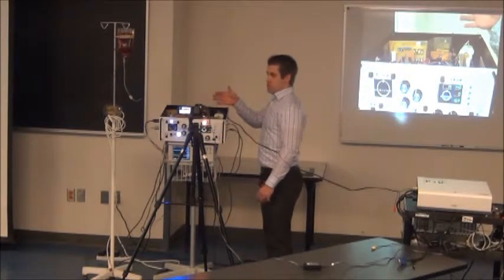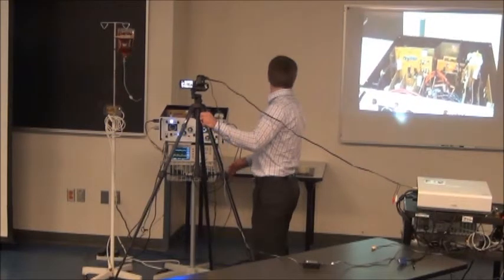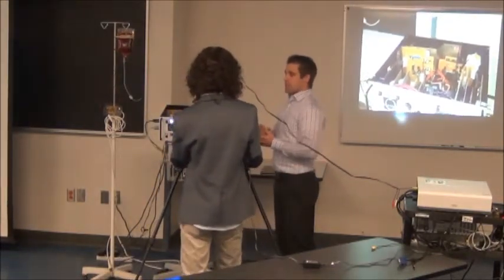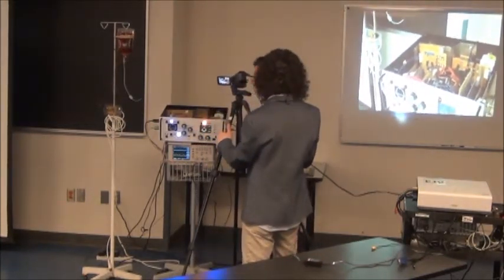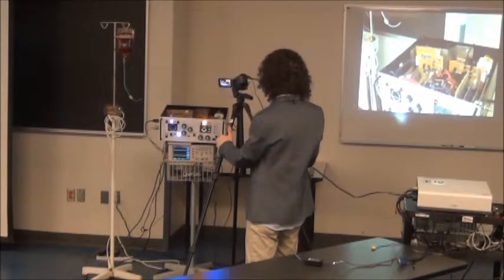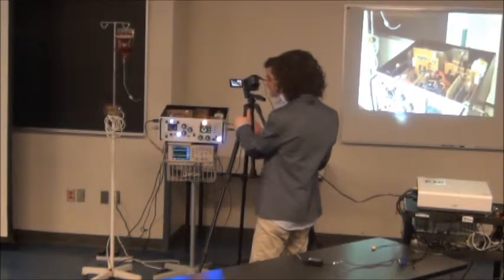We also have our power boards at the back, which are here, and our signal boards are at the front up here. And we used a Molex connector, which allows you to disconnect and reconnect the boards a lot easier. So we can use it for troubleshooting, or if you need to remove components. You pull the board out, put it back in after you're done. It's a lot quicker and easier than having to take out, say, 6 boards that are on top of one board.